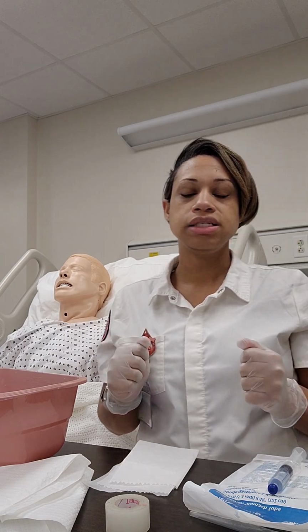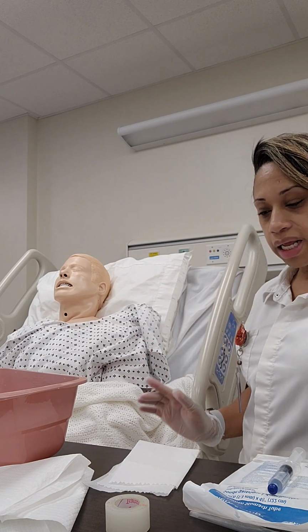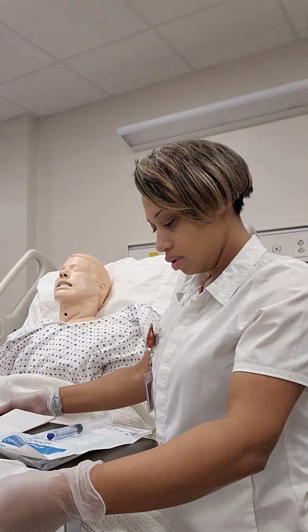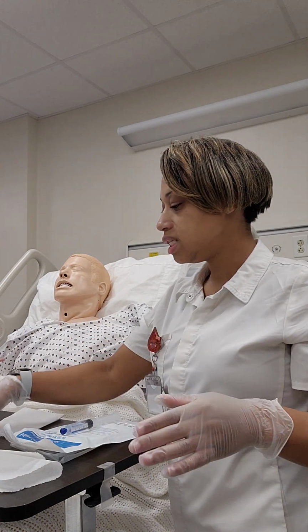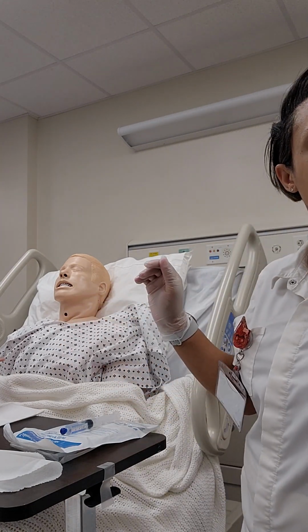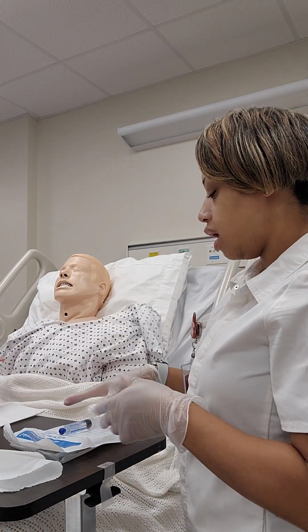Once they are placed, I will position my patient into high Fowler's position, which the patient is already in. I will have the bedside table over the patient, having the basin ready just in case the patient needs it. I have tissue. We're going to pretend this is water, a cup of water, if I need them to help with swallowing.